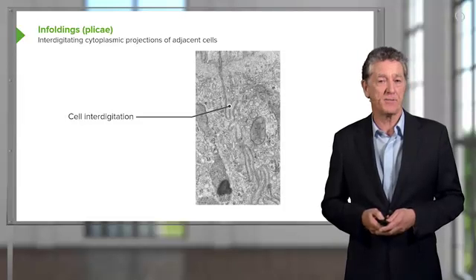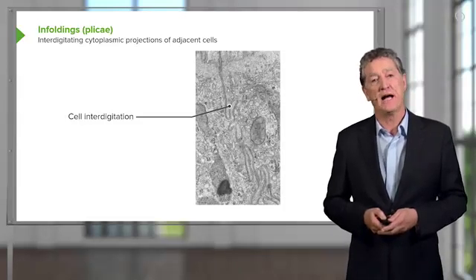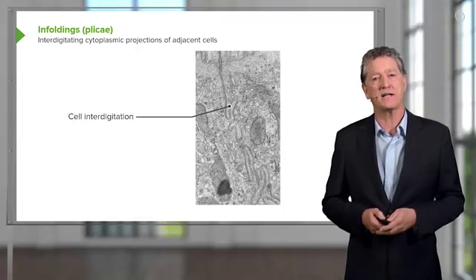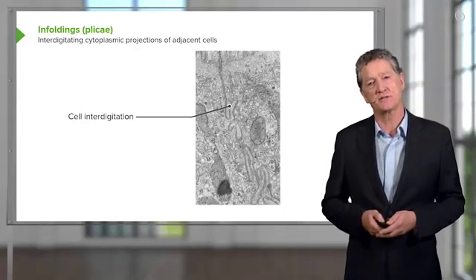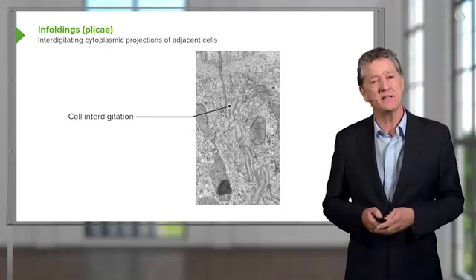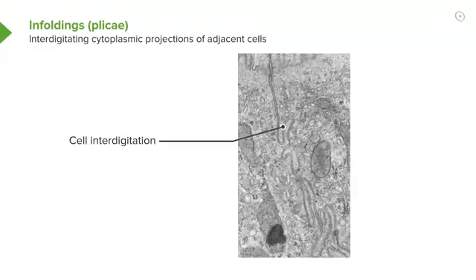And on the other image you see the section through an epithelium of the gallbladder, you can see white clear spaces between the cells. This is an example of where water is passing from the cell into these lateral spaces, and then the occluding junctions prevent that water from then going to the surface.